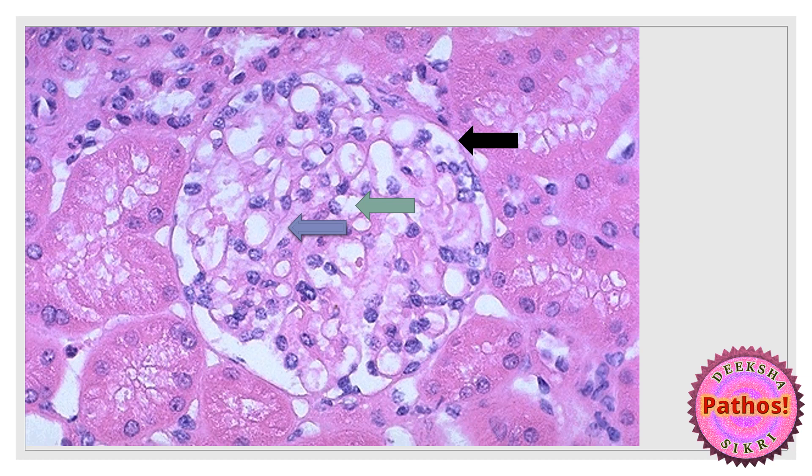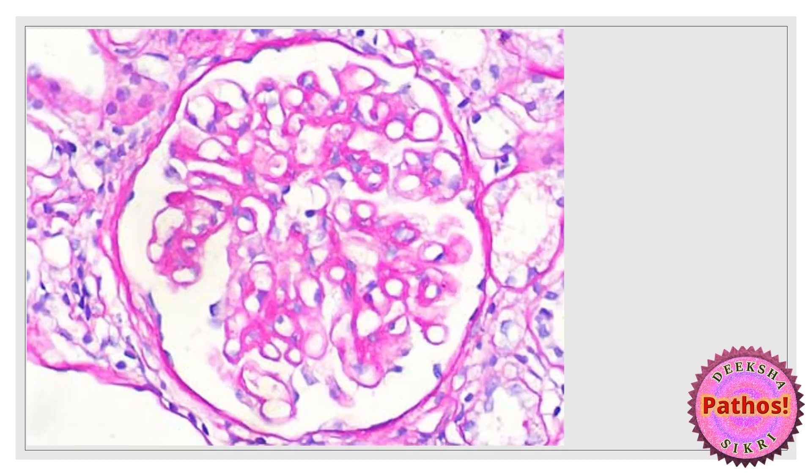On this level of microscopy I cannot see podocytes and their foot processes separately. That means if something is wrong with them — as in the very important disease called minimal change disease — the loss of foot processes is not visible on light microscopy, which is why it's called minimal change disease: hardly any change. Next photo is a PAS stain slide.